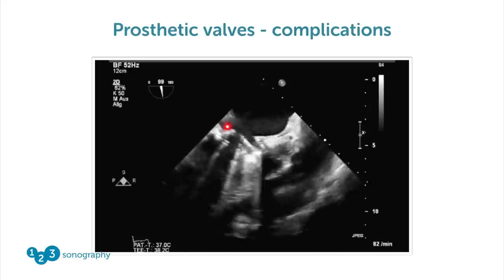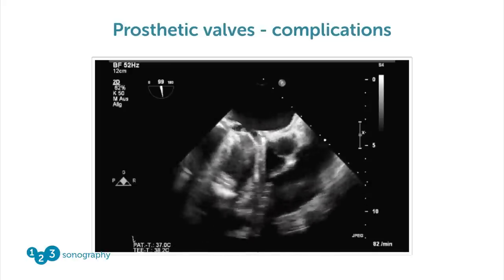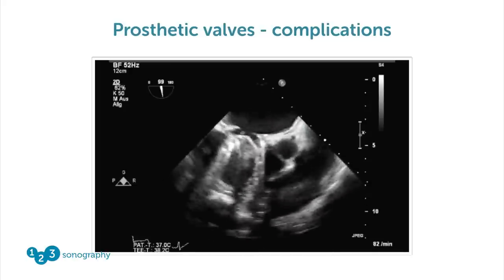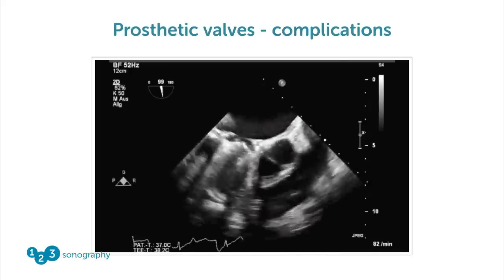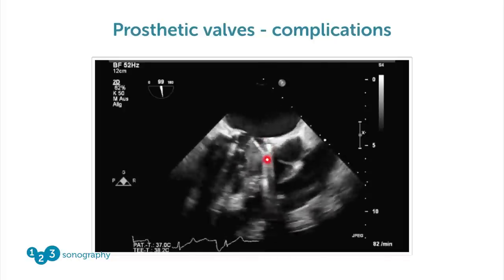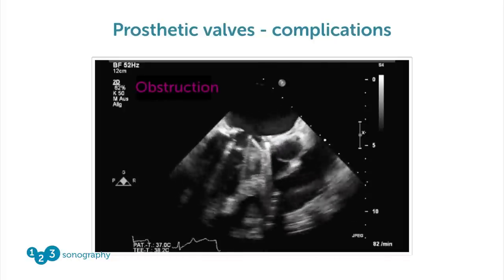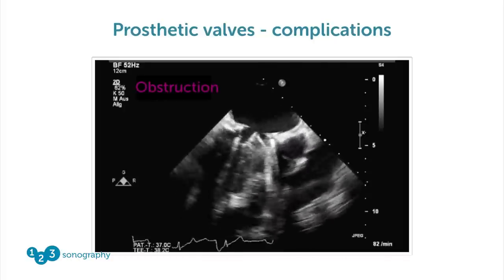We'll talk about that in more detail when we come to TEE. But at this point you can see that one of the leaflets is stuck — this is prosthetic valve obstruction.